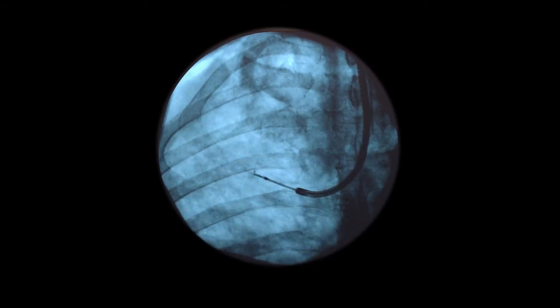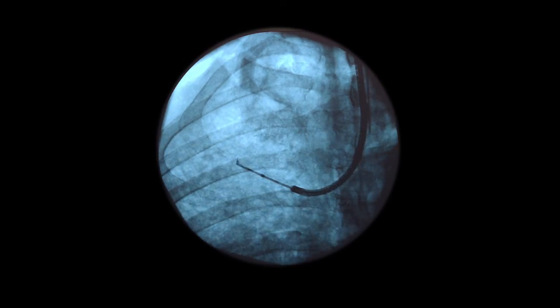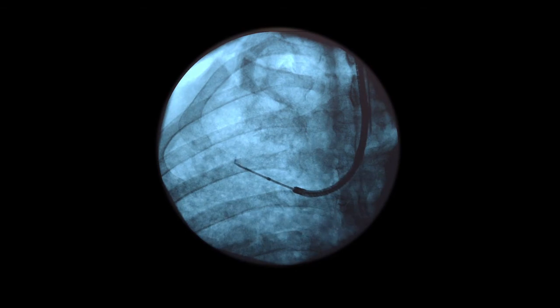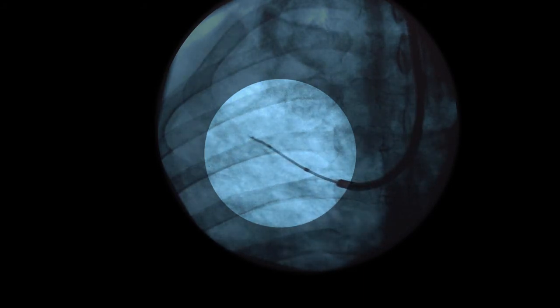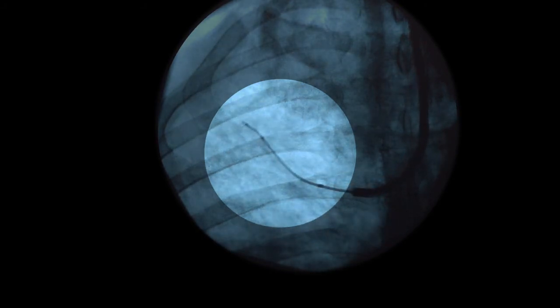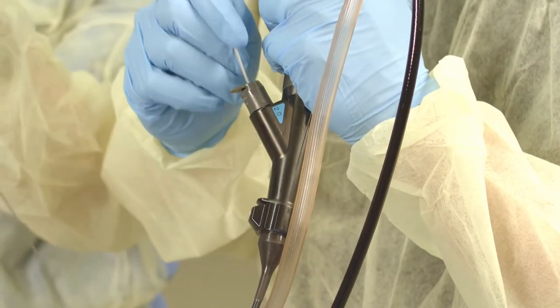The bronchoscopist must determine if he or she wishes to examine airways superior, inferior, anterior, or posteriorly. With the tip of the curette in the desired position, the assistant will advance the curette distally and will feel the tip catch on an airway if one is present. At this point, the curette is advanced carefully into the desired airway, and once positioned, the guide sheath is advanced into the desired airway over the directional curette. The curette is then withdrawn and the radial probe may be advanced into the new airway through the guide sheath.